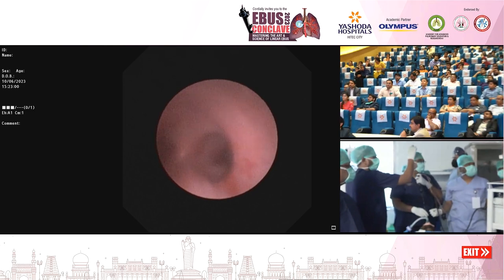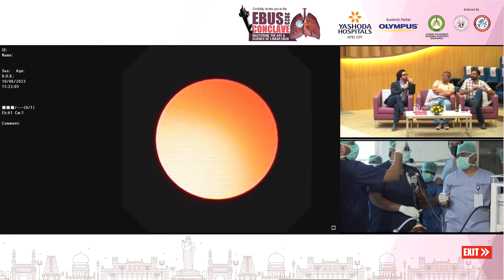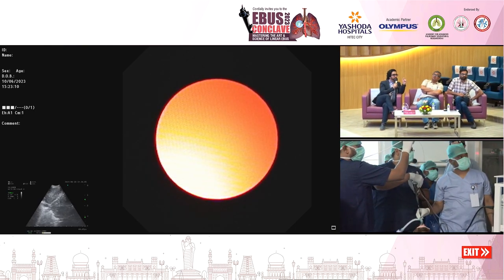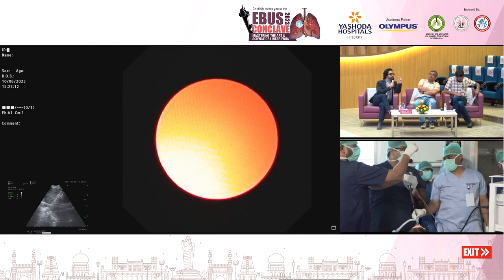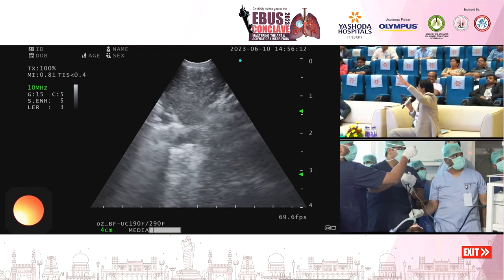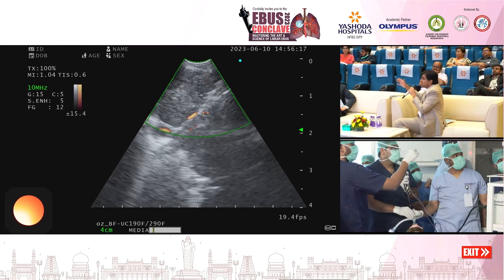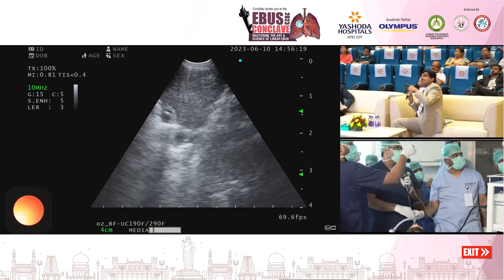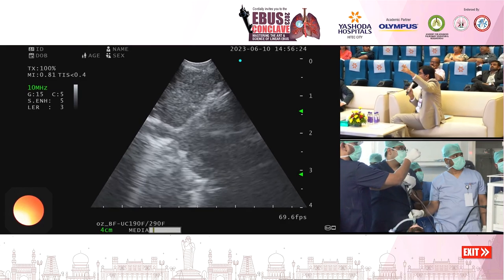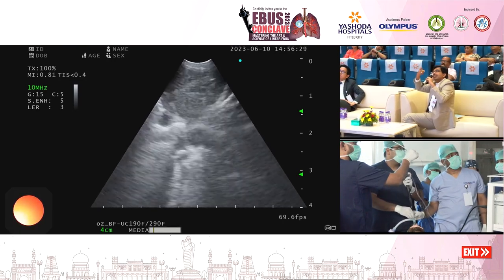Mostly it's the operator who takes the judgment if he is at the same place, because you might not achieve much even if you get to see the track that has been created. You won't be able to put it across it. The most important thing is to remember the location where you punctured on the endosonographic vision. On EBUS vision, you have a rough idea as to where you punctured. Sometimes you can see the track either as a hypoechoic line or sometimes as a hyperechoic line. Even without the needle, sometimes if you move, you can see that line.